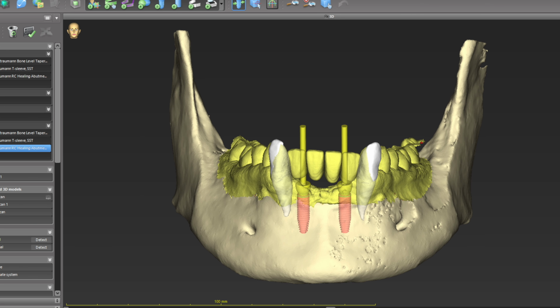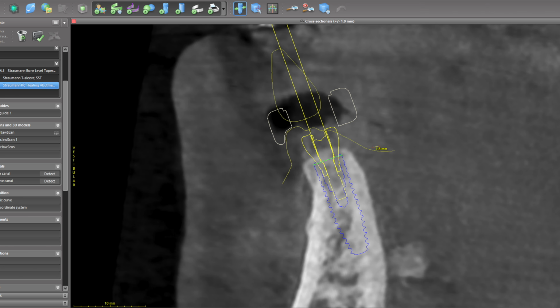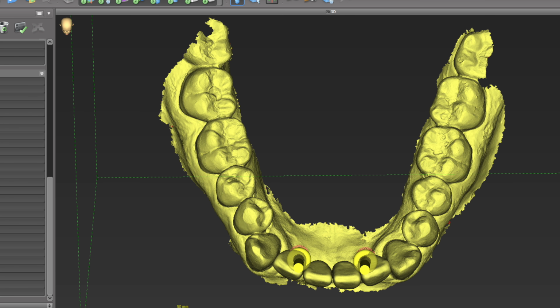be going. So as technology improved and we were able to incorporate CT scans into our practice, we're able to incorporate intraoral scanning, we can now overlay those two, and now we have a full picture of where the tooth needs to go, where the implant needs to go, and where your anatomy as far as bone is concerned needs to go. It also allows us to see vital structures like your sinus cavity or nerves that we want to avoid with the placement.